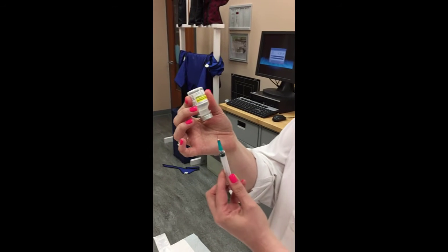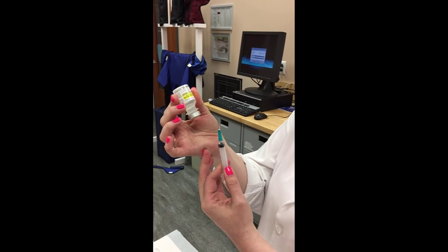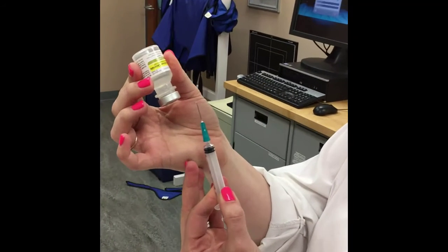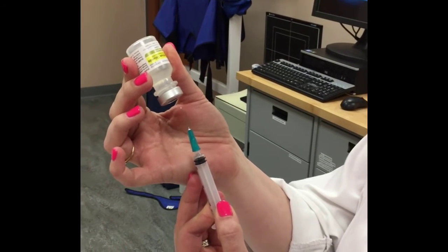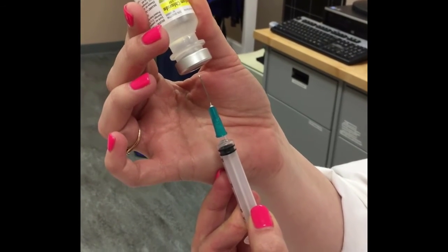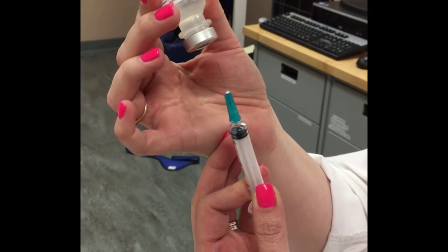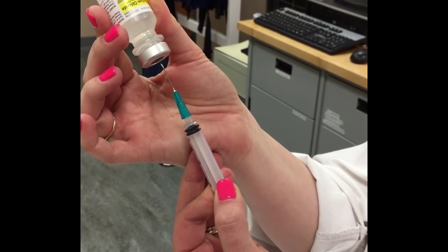So what I'm going to do is, you can see how I have my fingers resting on the base of my hand that's holding the medication. That's to help give me extra control of my needle, especially when you're first learning, as students tend to be a little bit nervous and their hands can shake a little bit. So it does help to have your hands resting on the base of your other hand holding the medication to give you that extra control.